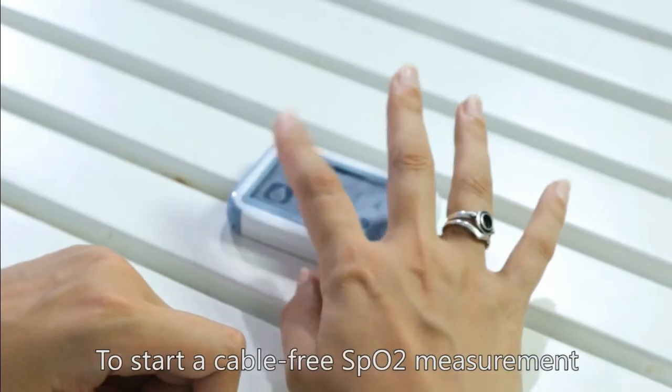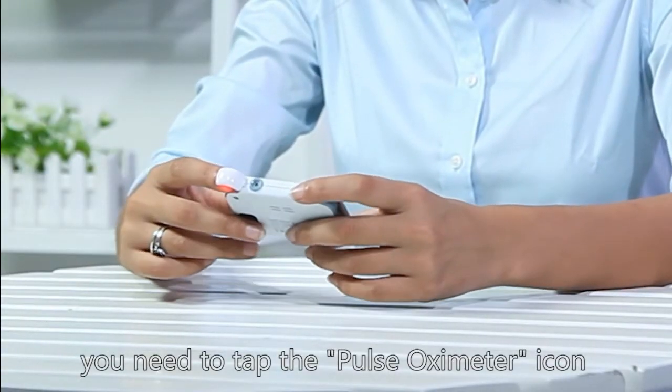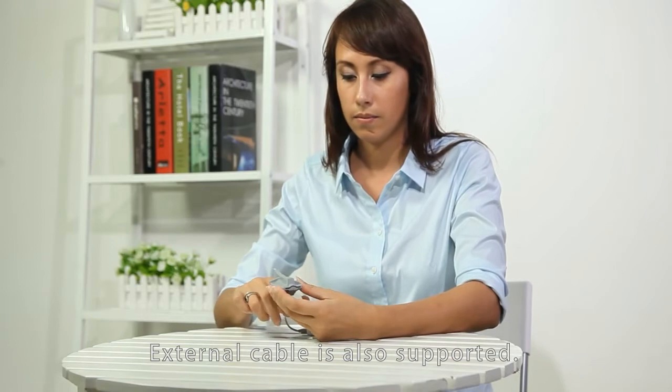To start a cable-free SpO2 measurement, tap the pulse oximeter icon and insert your forefinger into the built-in sensor. External cable is also supported.